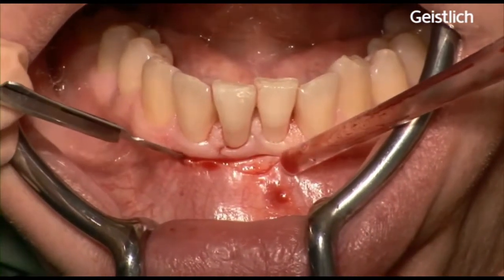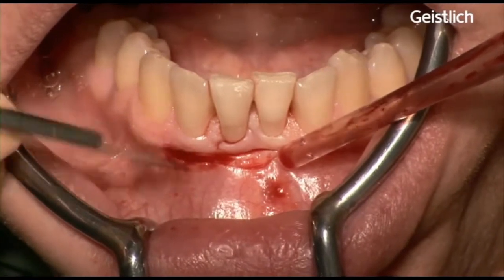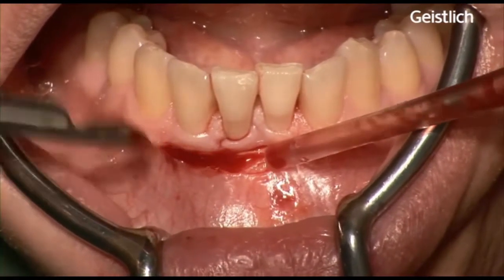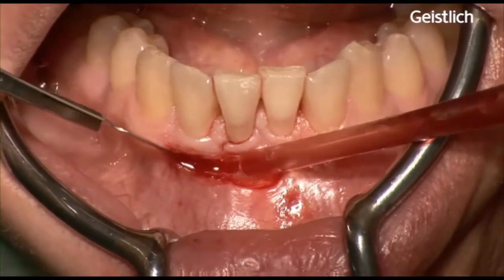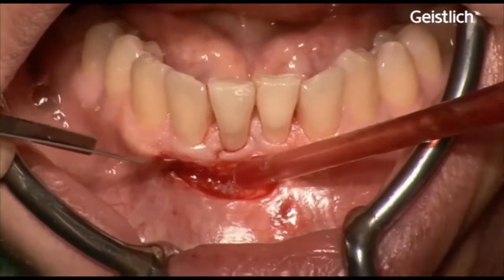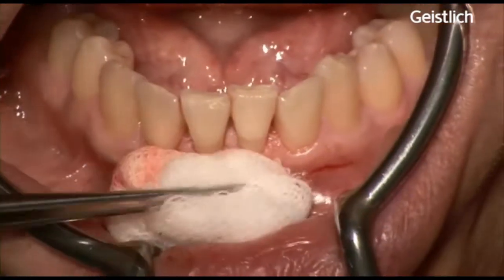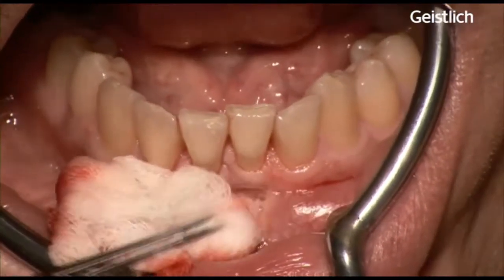A split-thickness flap is prepared and care has to be taken not to cut through the periosteum. We proceed downwards until it is possible to move the flap passively in an apical position. To permit the apical advancement of the flap, eventually some muscle insertions have to be eliminated. The blunt dissection is extended laterally to such an extent that the flap stays tension-free when positioned apically to the level of the desired width of keratinized gingiva.